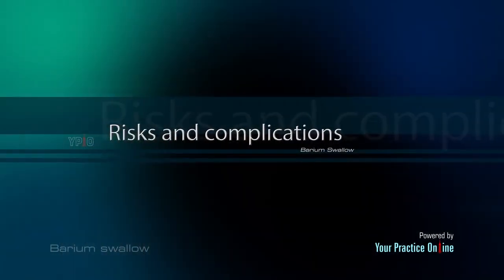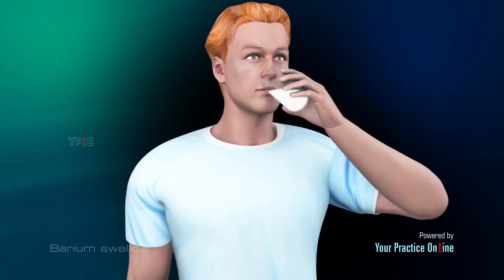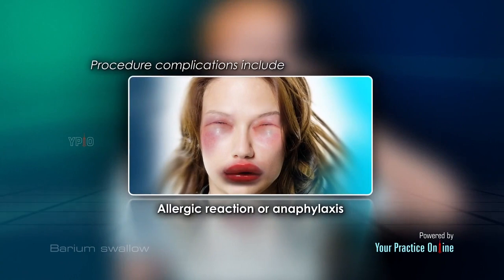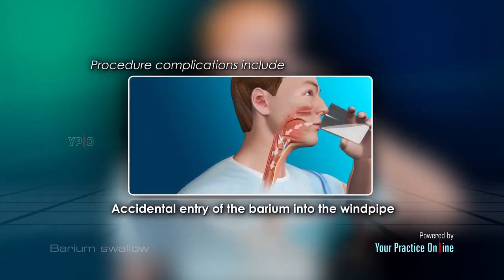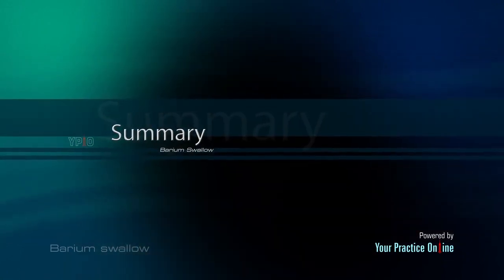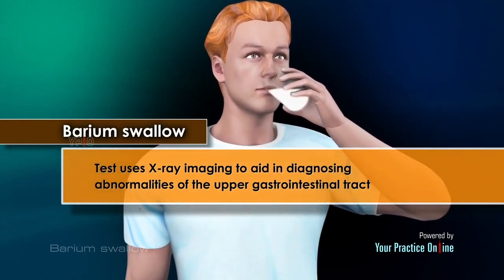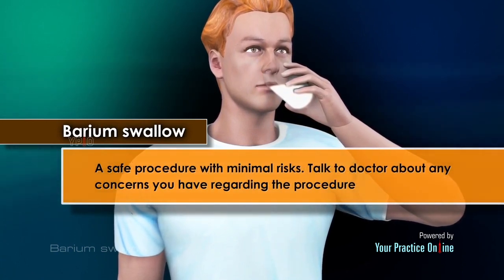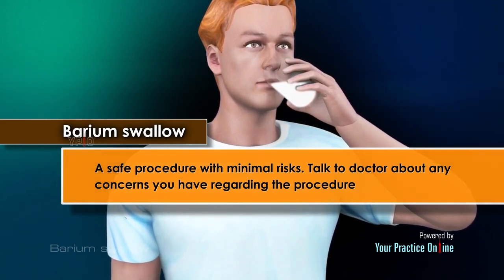Risks and Complications: The barium swallow is generally a safe test, but complications may occur and can include allergic reaction or anaphylaxis, constipation, and accidental entry of the barium into the windpipe. A barium swallow test uses x-ray imaging to aid in diagnosing abnormalities of the upper gastrointestinal tract. It is a safe procedure with minimal risks. Talk to your doctor about any concerns you have regarding the procedure.